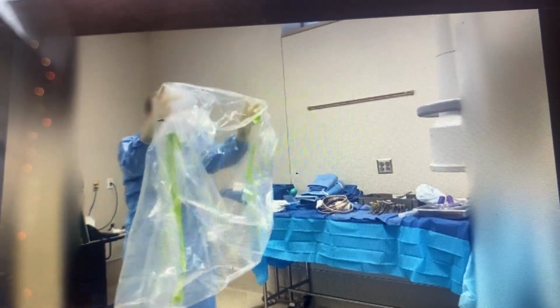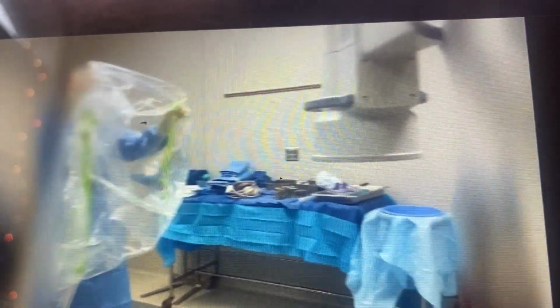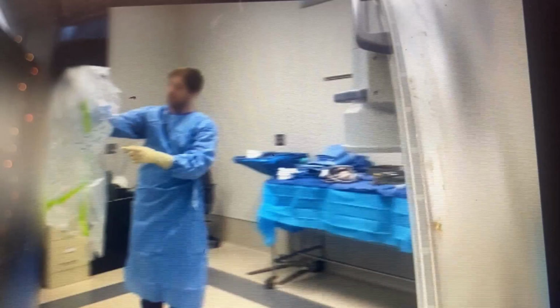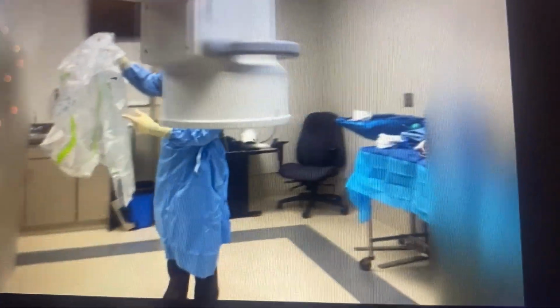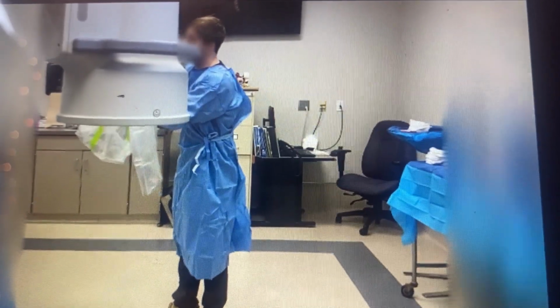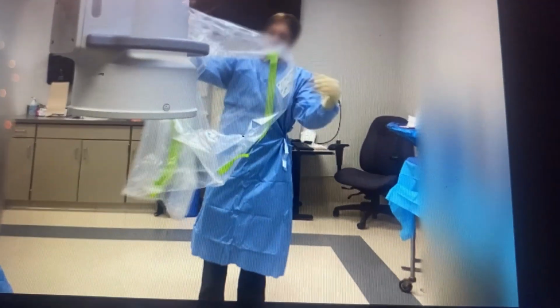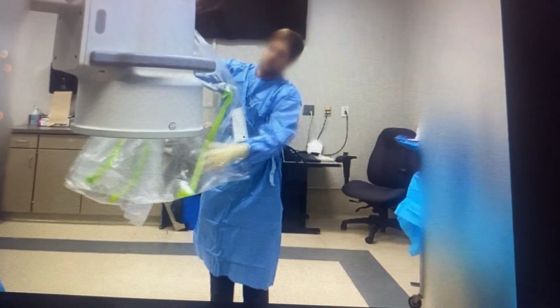Surgical nurses, surgical techs, and more sterile personnel prep for surgeries. During this prep time, we drive the C-arm into the surgical suite. It's important to place the C-arm in a position out of the way of their prep and the sterile field. While the surgical techs are setting up their trays, they will come and drape the C-arm. Here's the process of them draping the C-arm.